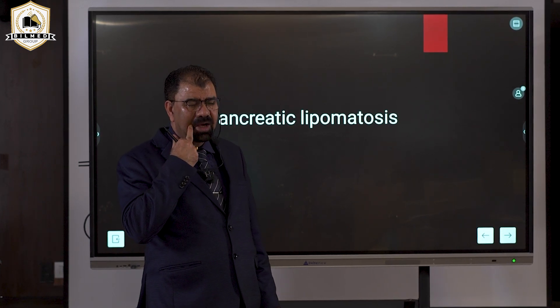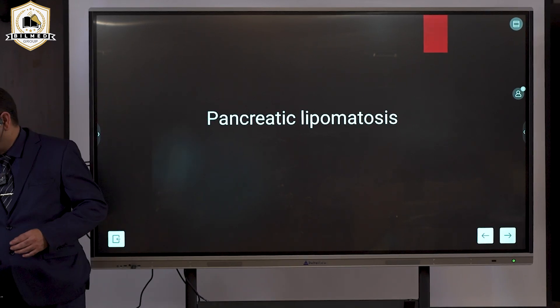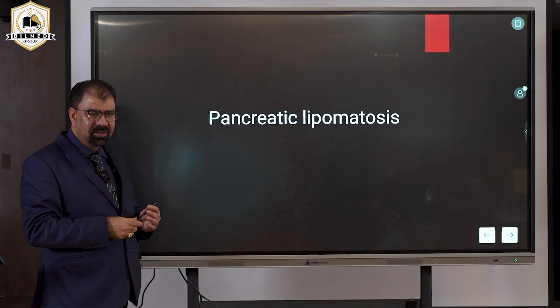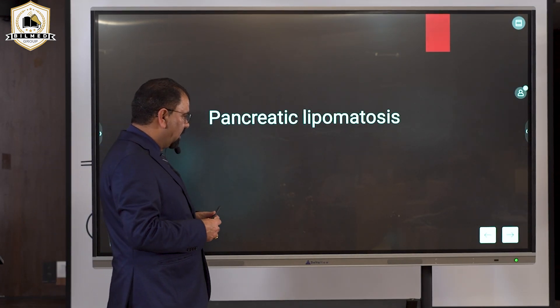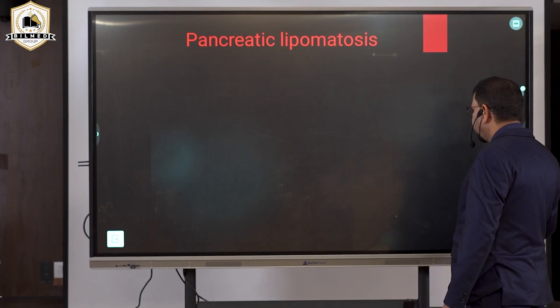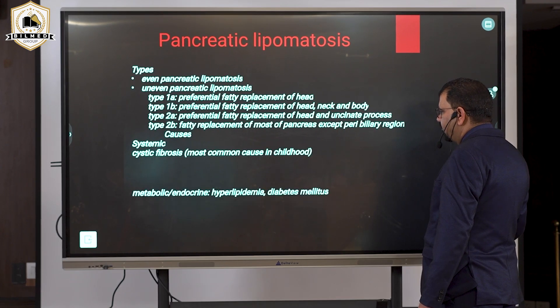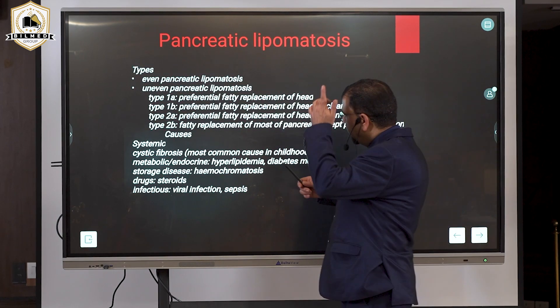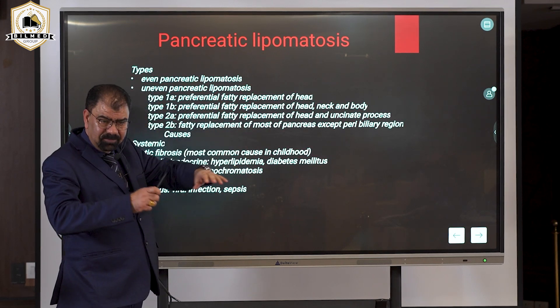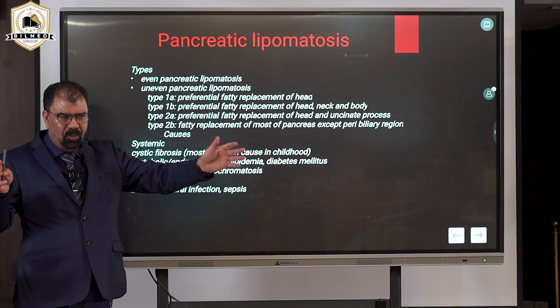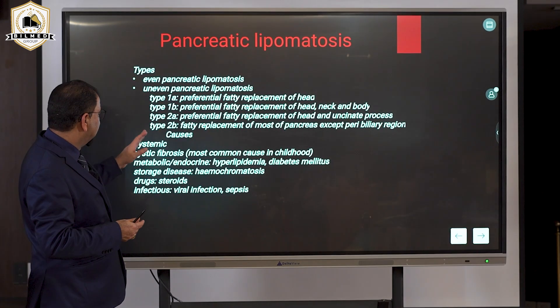Starting our session on the lipomatous pancreas. In lipomatous pancreas, there is high echogenicity in the pancreas and the pancreatic size will be increased. The pancreas overall, from top to bottom and right to left, is increased — that is diffuse fatty infiltration.